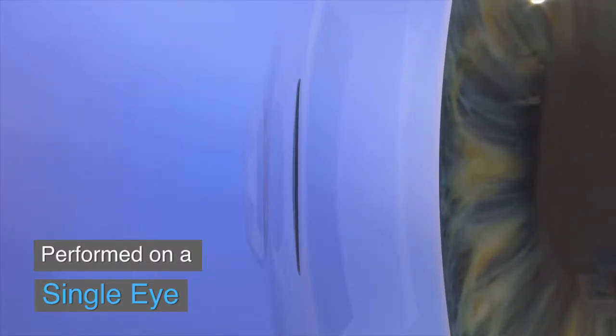Instead, the inlay is gently placed in the first few layers of the eye in a simple 10 minute LASIK-like procedure.